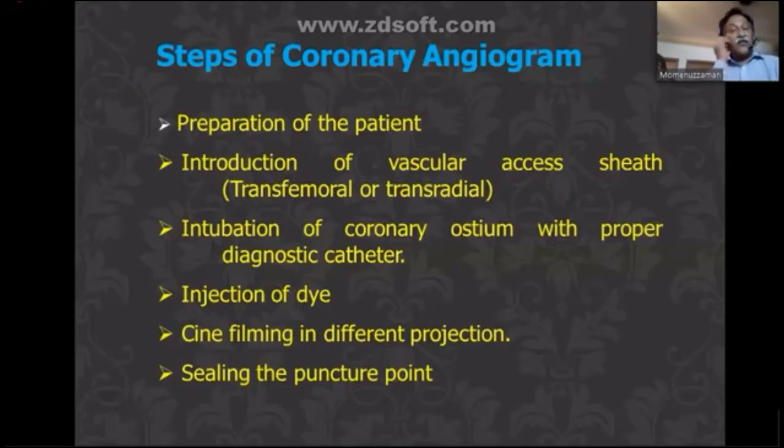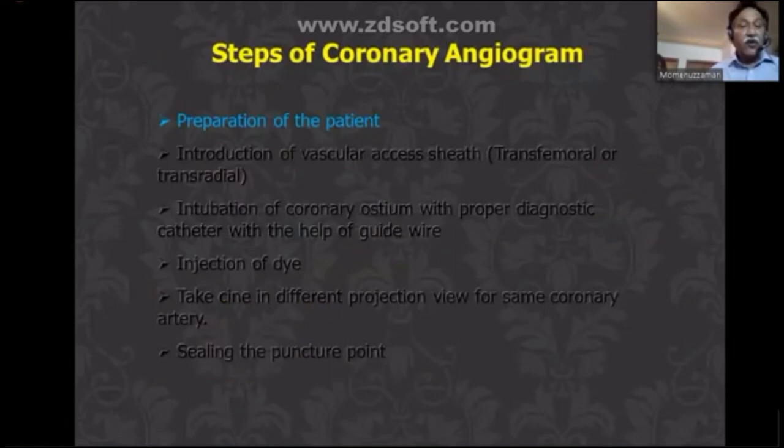Now, what are the steps of the angiogram? Preparation of the patient, the vascular access, intubation of the coronary ostium, dye injection, cine filming, and sealing the puncture. And one by one, I'm going to talk about them, starting with the preparation of the patient. Preparation of the patient is very important. The reason is this.